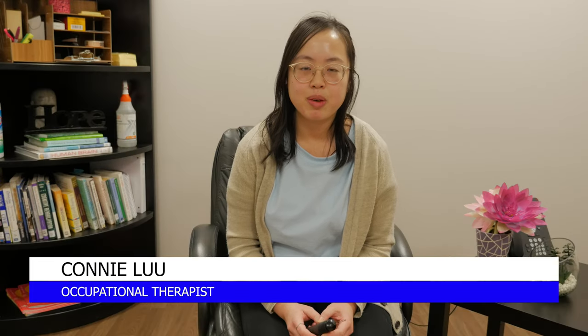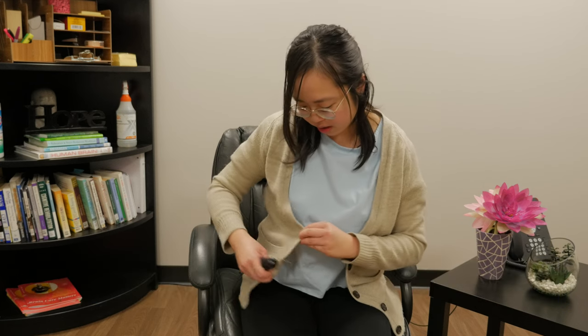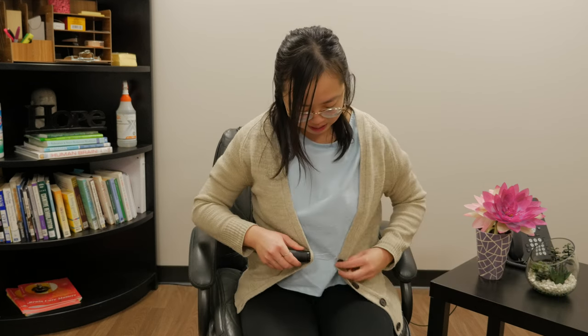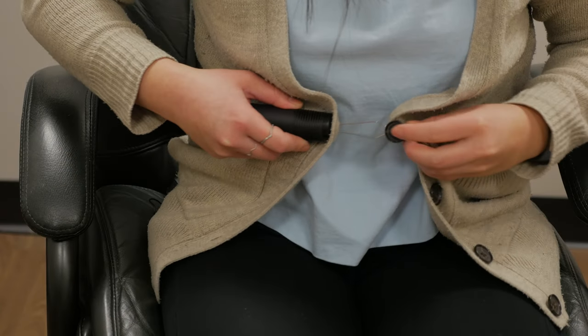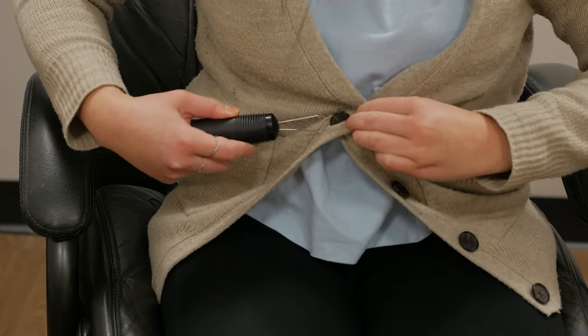Doing your buttons can be tricky with decreased fine motor dexterity. One tool that can help is called a button hook. All you do is feed it through the hole, then slide it over and hook the button on the other side, pull it through, and then take the button hook off.